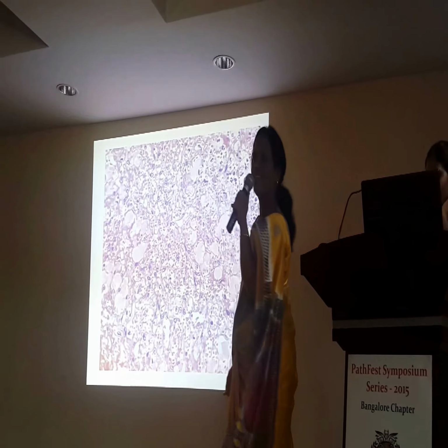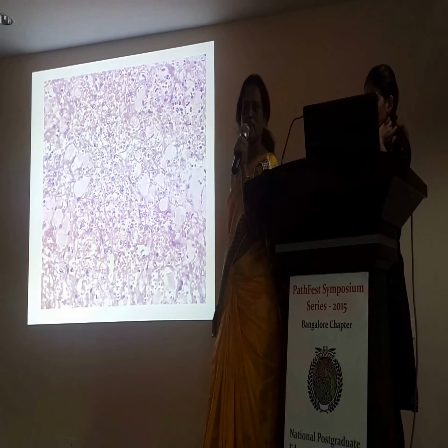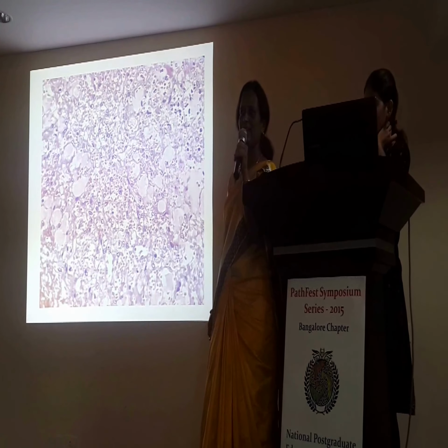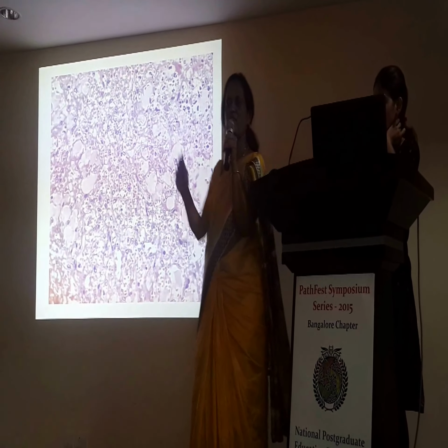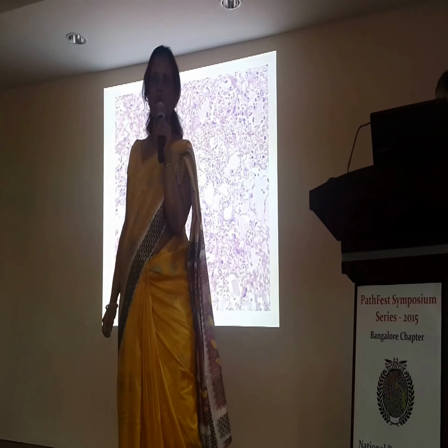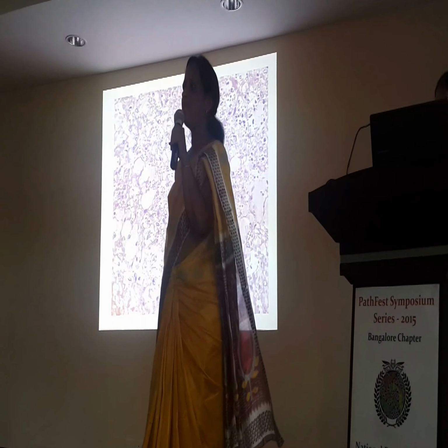Spleen. So the lady was operated, I said. Laparotomy was done and this specimen came. She had repeated pain abdomen, and a continuous dragging pain also. If you have identified this as spleen, dragging pain, pain abdomen, what could be the reason? Splenomegaly.